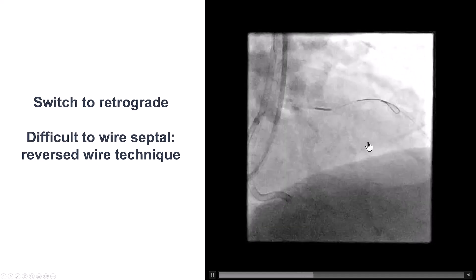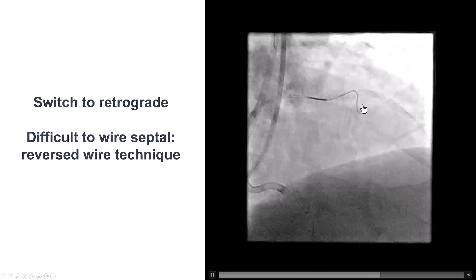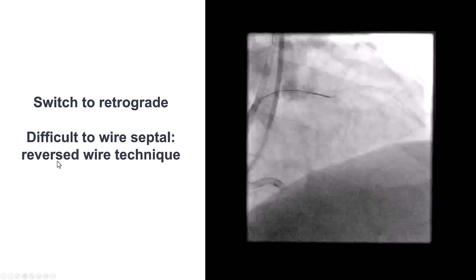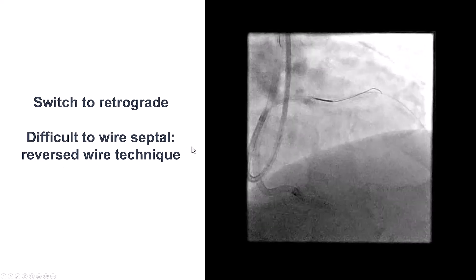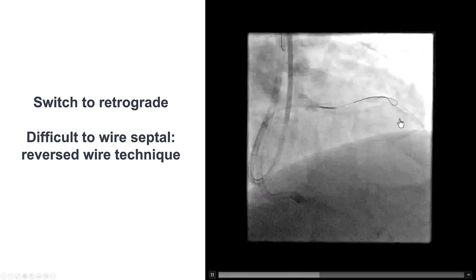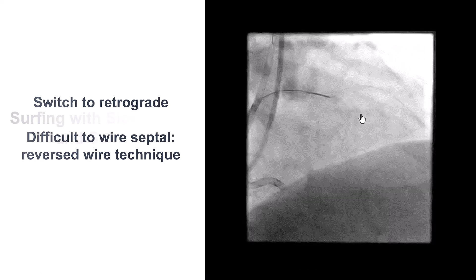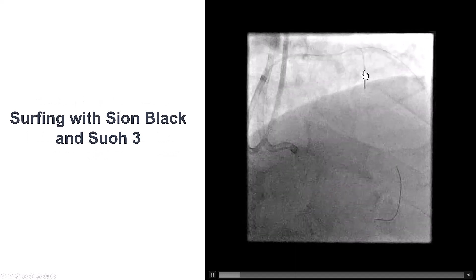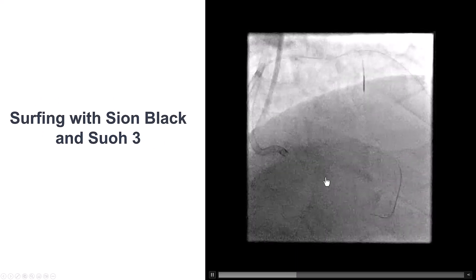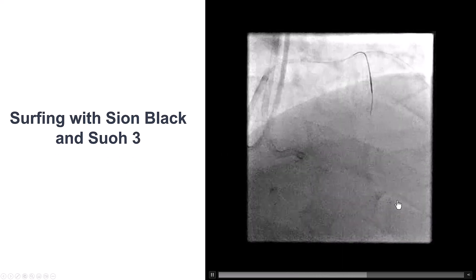We had a lot of difficulty getting into the septal collateral, which had a retroflex origin. This was solved by using the reverse wire technique — advancing a polymer-jacketed wire bent about 3 cm from the tip, then pulling it back so it hooks up the septal. We then inserted our microcatheter and did surfing with a Sion Black and SUO3 guidewires, but had a lot of difficulty getting through that septal.